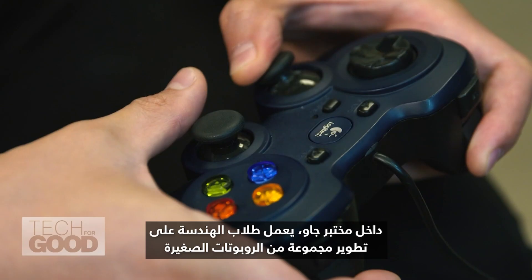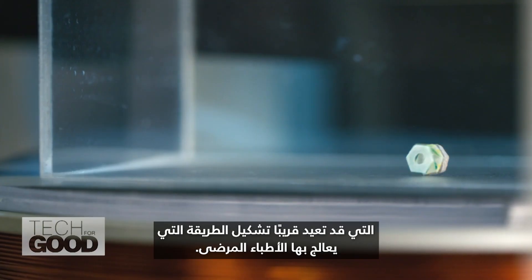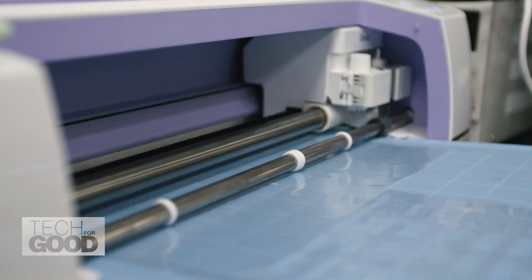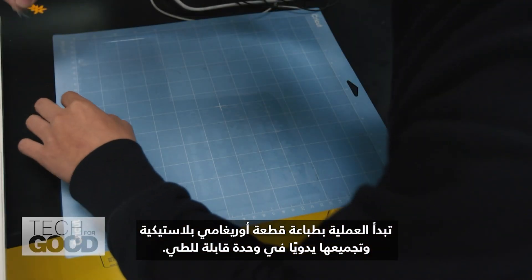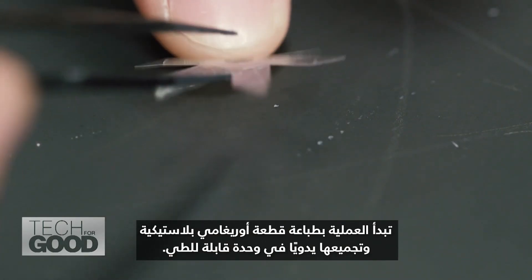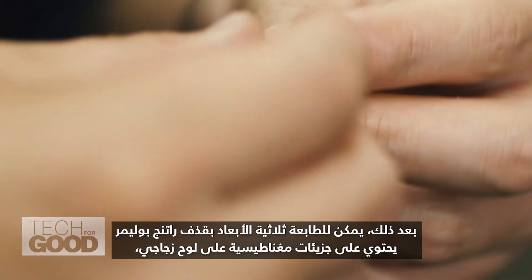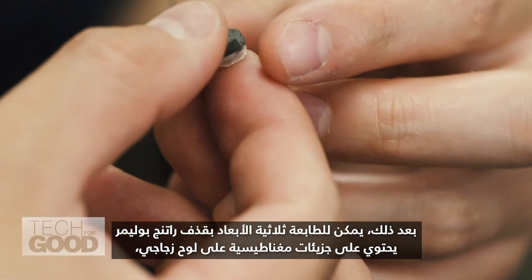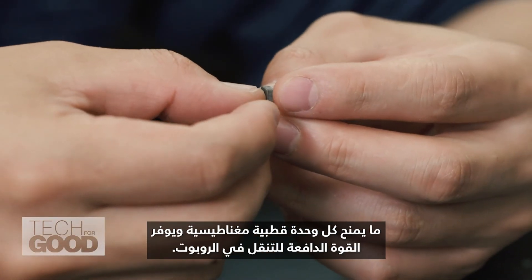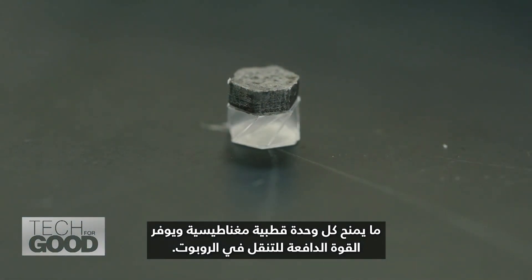Inside Zhao's lab, engineering students are working on developing a host of tiny robots that may soon reconfigure the way doctors treat patients. The process begins by printing out a plastic origami cutout and manually assembling it into a single foldable unit. After that, a 3D printer extrudes a polymer resin containing magnetic particles onto a glass plate, which gives each unit a magnetic polarity and provides the driving force for the navigation of the robot.